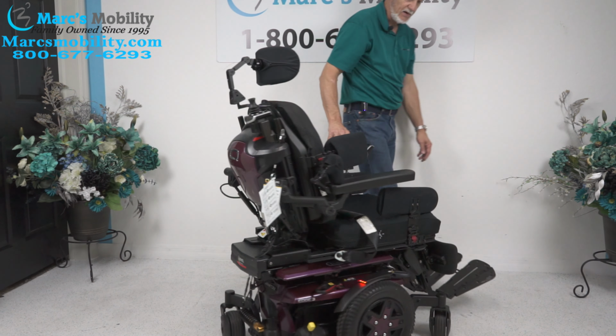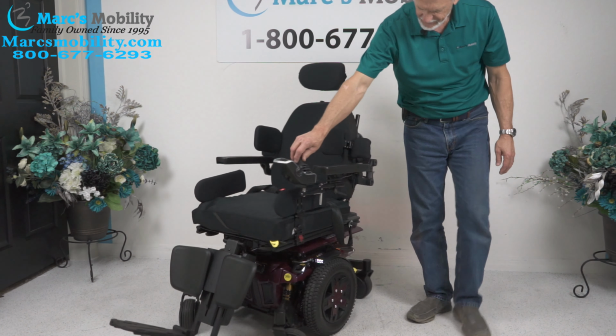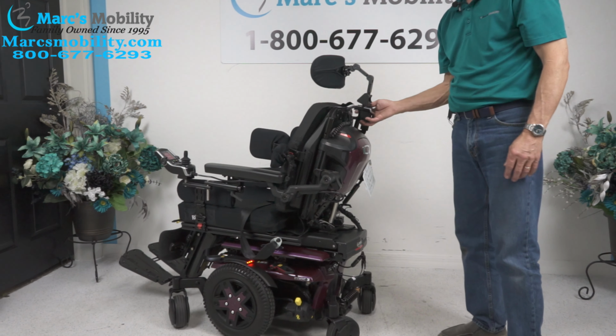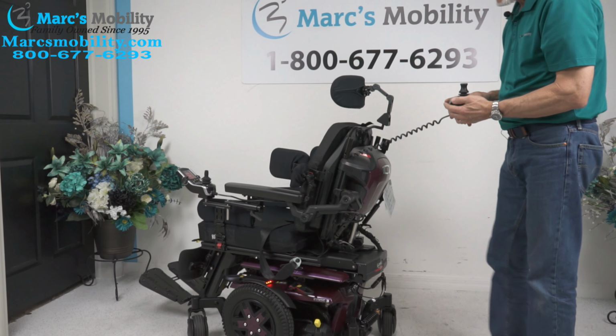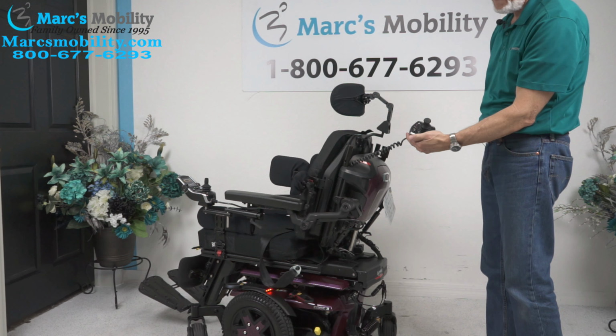Unless I move the joystick on an angle. So, this is a mid-wheel drive chair. Also with this chair, back here, we have what's called an attendant control. So I can drive this chair from back here. So if I switch it over, okay, right here, or right here maybe, there we go.